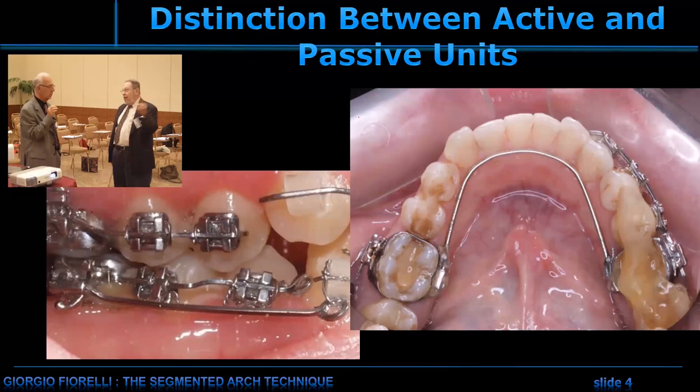I would like to discuss with you the segmented approach and how to work with passive units. It's very unlikely that I'm thinking of a treatment where all teeth are moving.